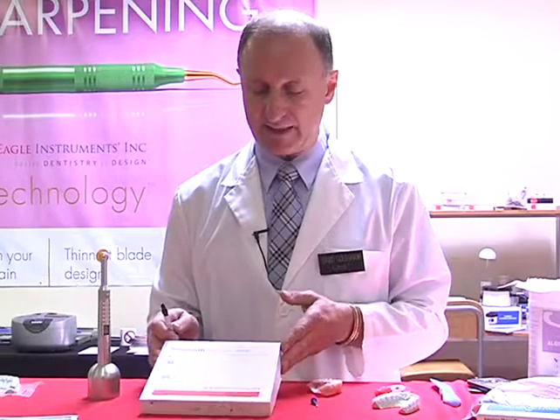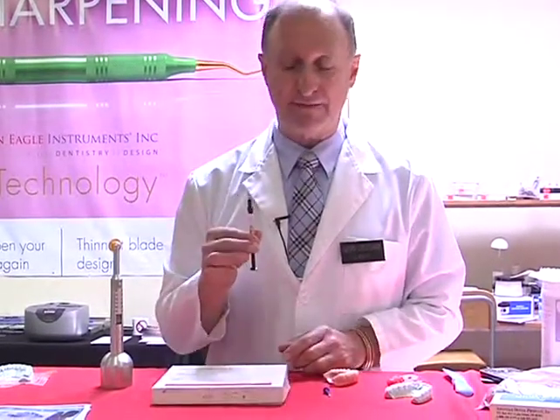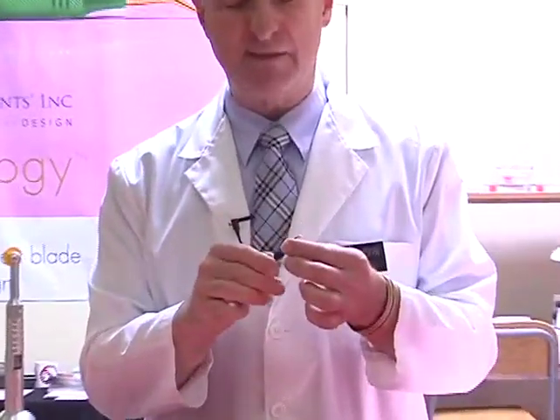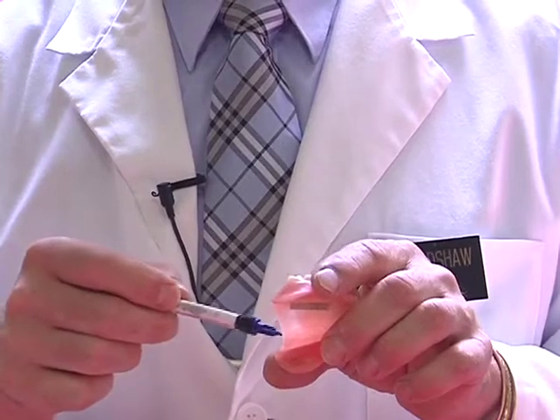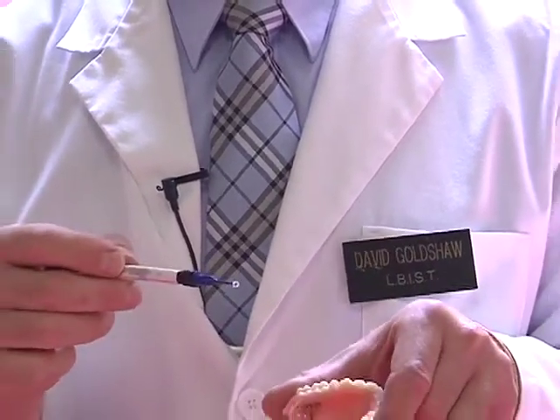This is called the Bosworth Gorilla Seal Kit, and inside are 3 of these syringes. Pop one of the little fuzzy-tipped ends on the surface of the syringe. Squeeze a small amount until this is moist, and then apply a small amount of that mixture just over the area we've just written.